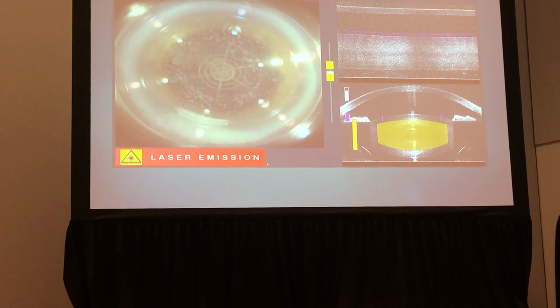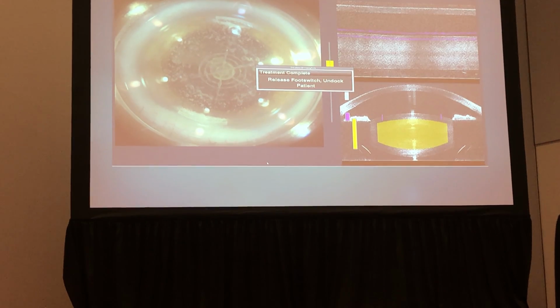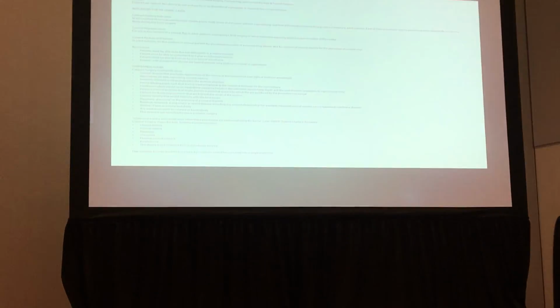So we're doing the arcuate incisions. We have 5, 4, 3, 2, 1. Vacuum's off. And we're going to go ahead and go up. She did a beautiful job.